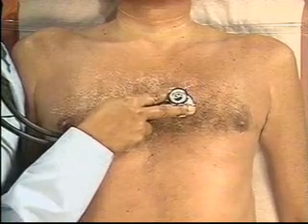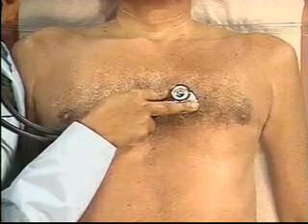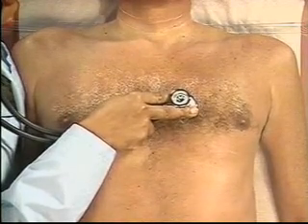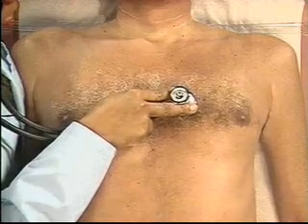Continue to breathe deep. Proceed along the left sternal border to the third interspace. Again, listen for splitting of S2.